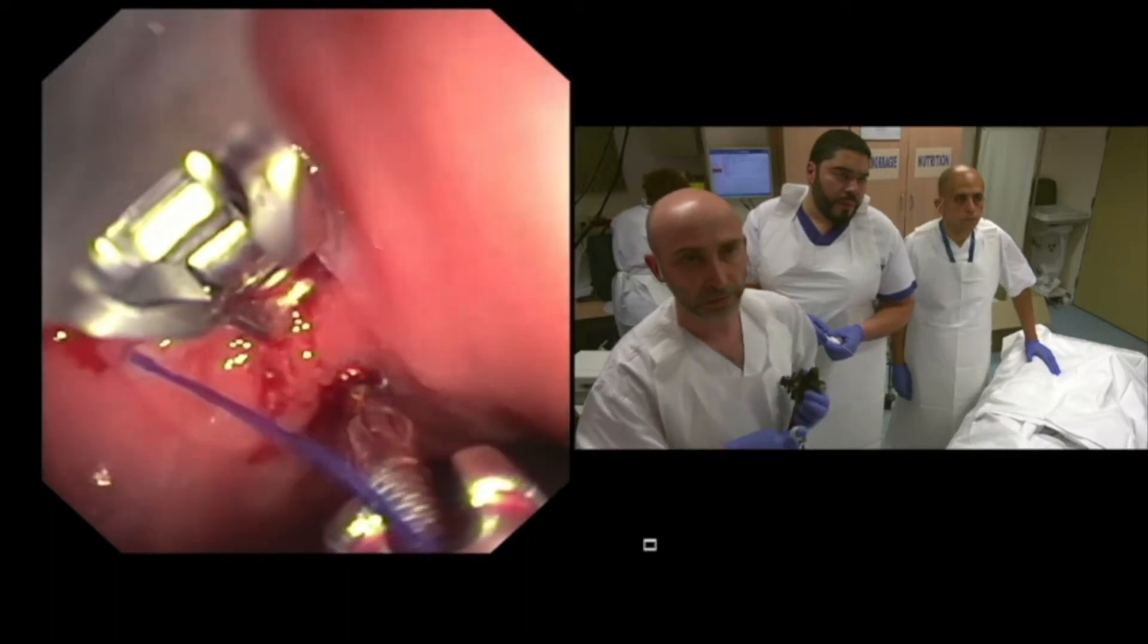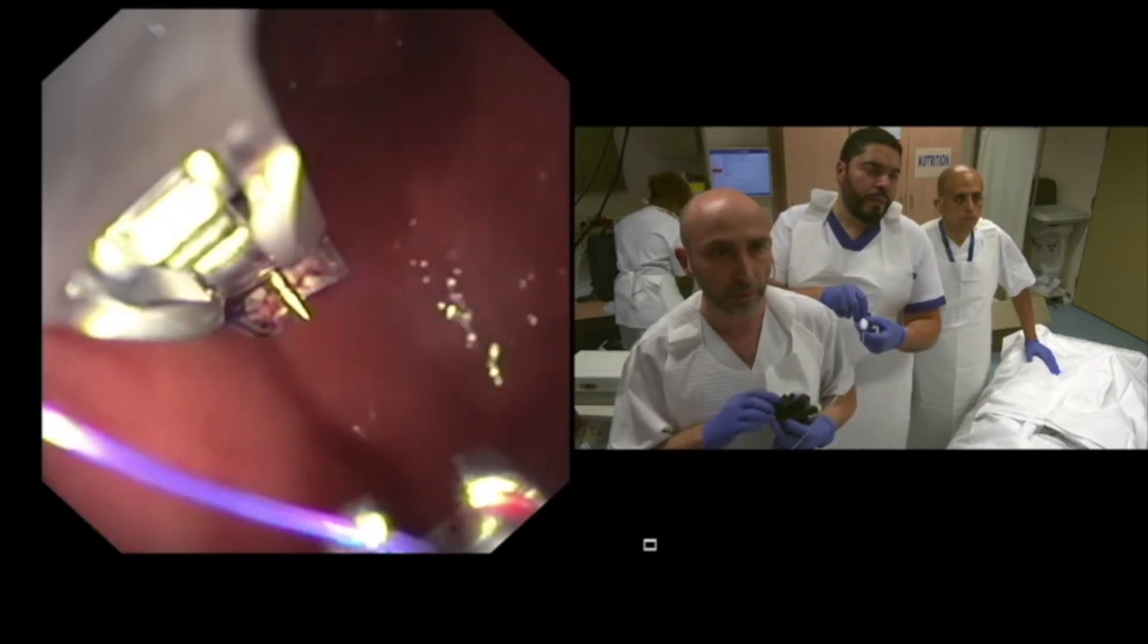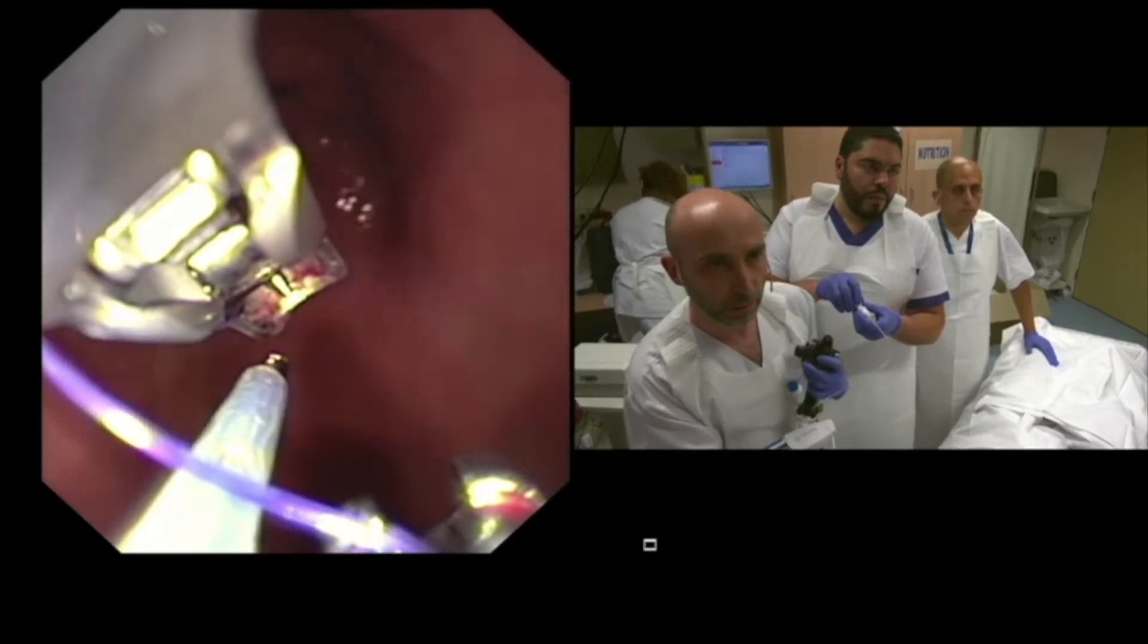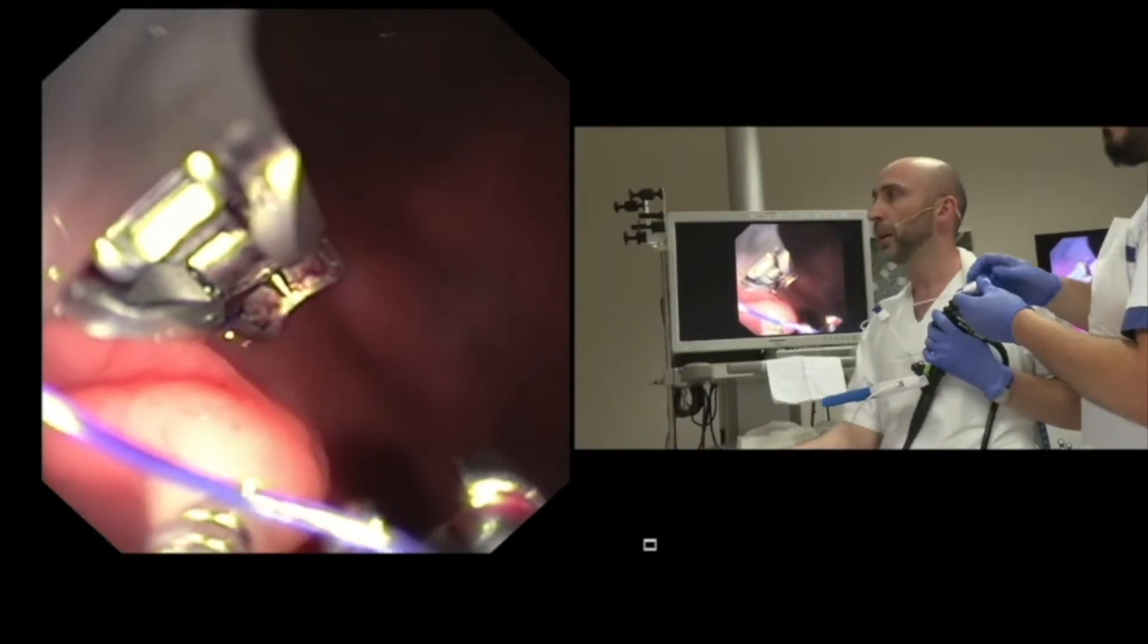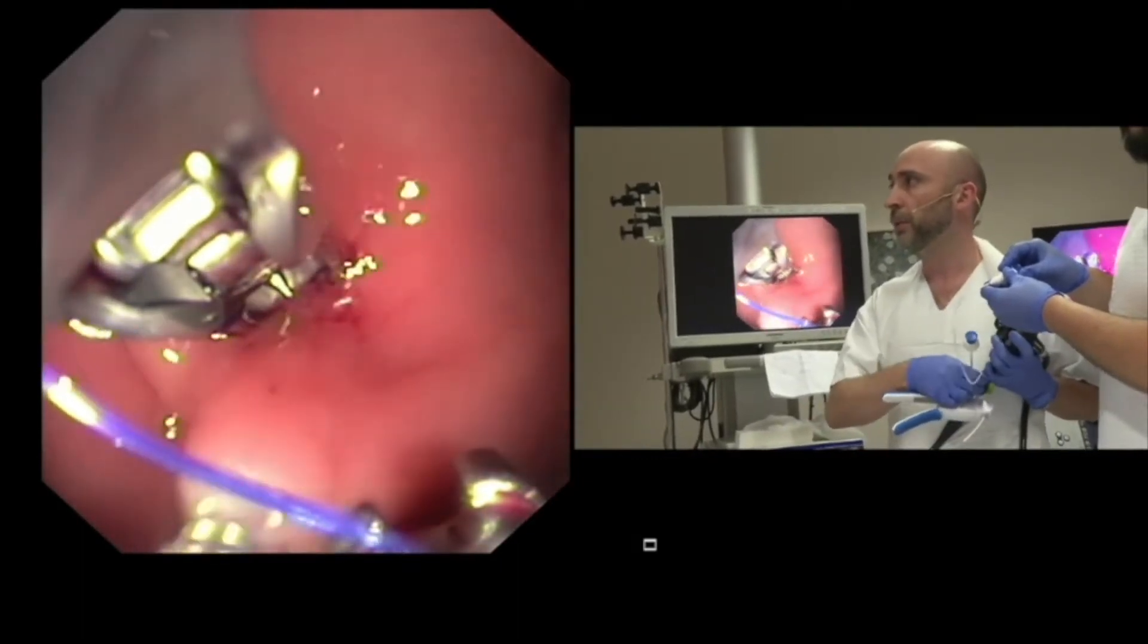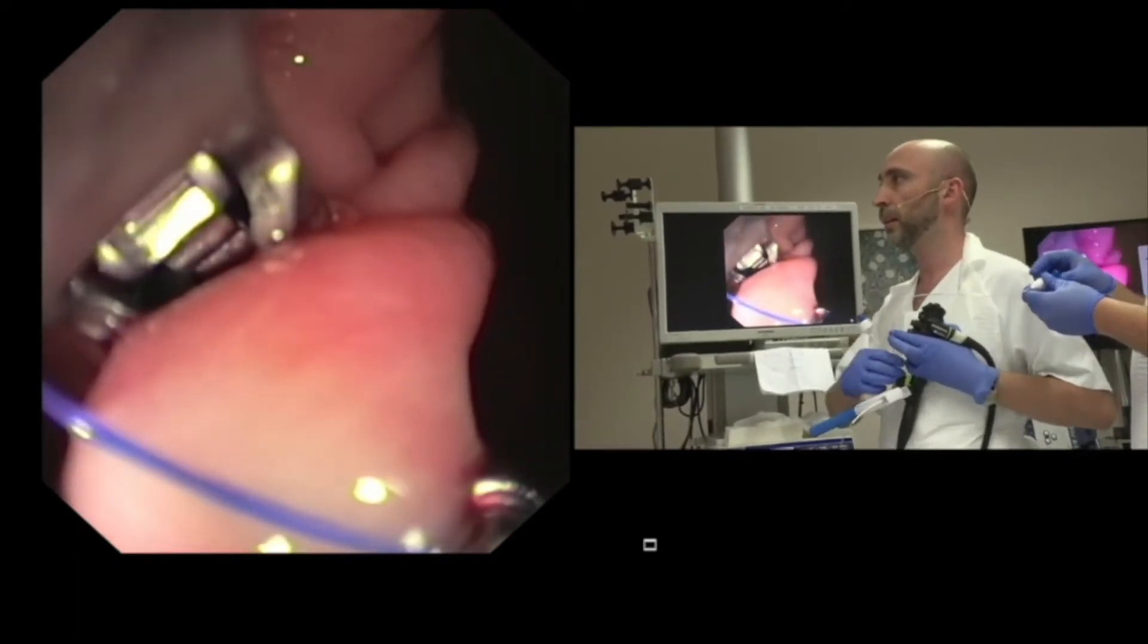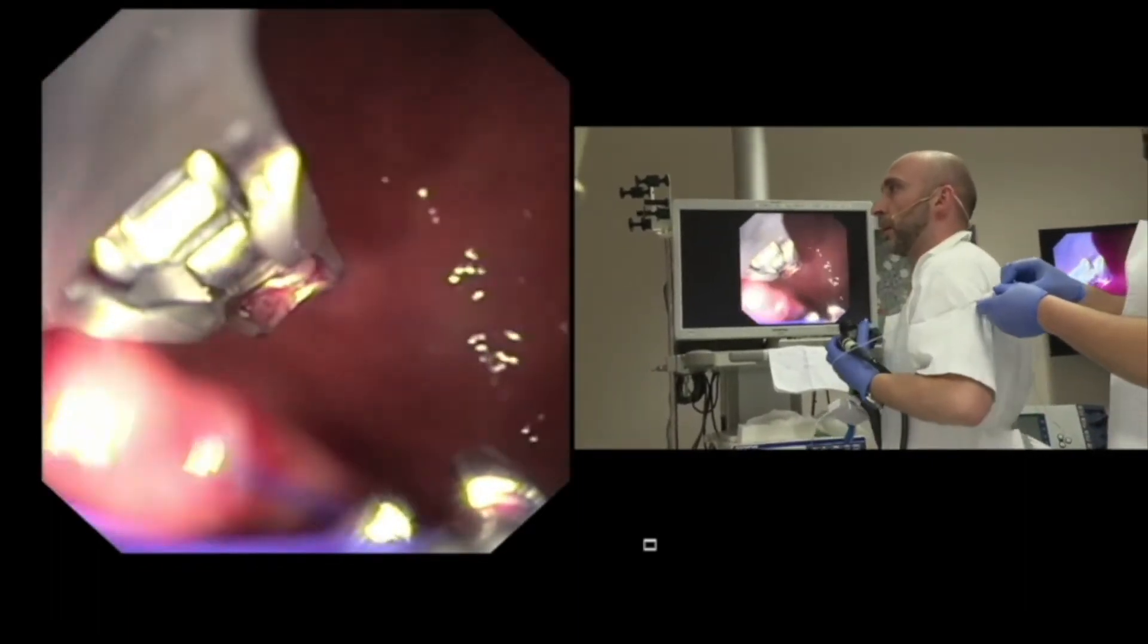I can place the second either from here or from the other side. I will decide to place it from here. I am reloading, pushing the needle, opening. And since the stomach is pretty big, we will place another one here. We are going down. Three rows: one, two, three. You see I am pulling back the scope, trying to be far from the gastric wall as far as possible. Some down, holding, taking back the needle. Second stitch placed.